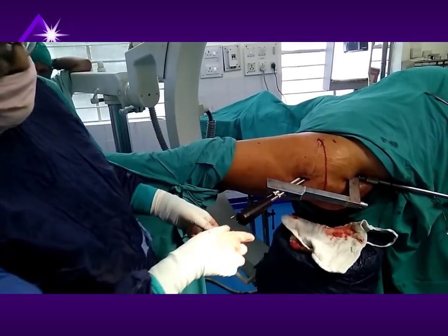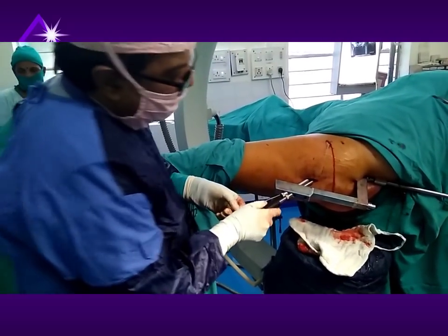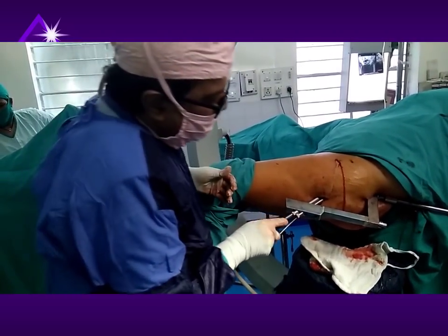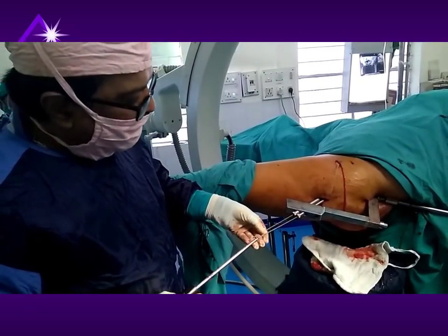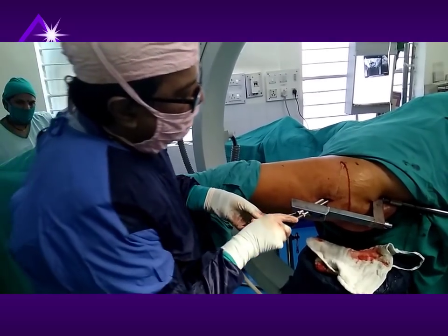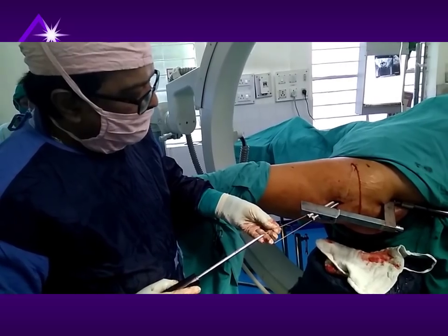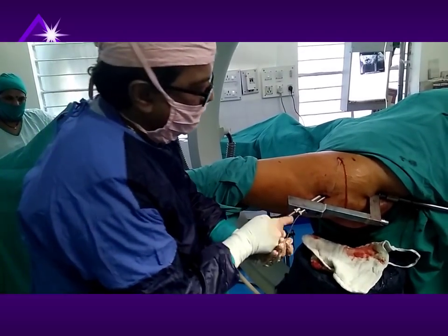I have passed both the screws, and I hope this video runs. This is how both the cervical compression screw and the PFN superior screw, the derotational screw, and the inferior screw compact the fracture. Again, I'll go back to the superior screw. This is all lying outside after releasing the traction, so the traction has been released from the foot end of the table and will prevent the effect of gravity.